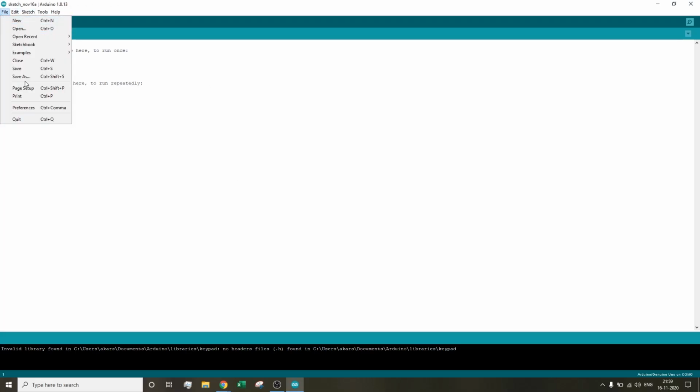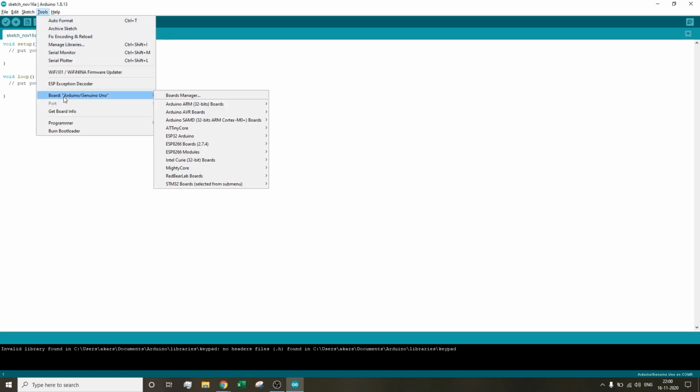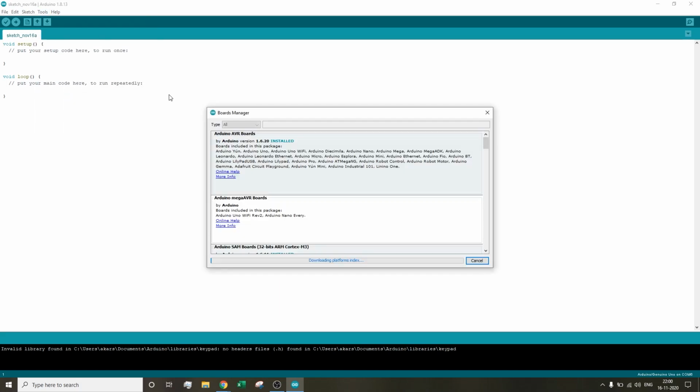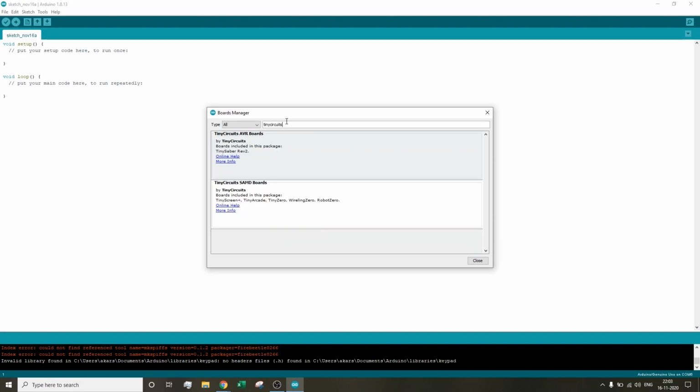In the IDE, we need to head over to Preferences and paste the URL in the additional boards manager URLs separated by a comma. Once that is done, we need to go to Tools, then Boards, and then Boards Manager. In the Boards Manager, we need to install the Arduino SAMD boards. Once that is done, you need to install the Tiny Circuits SAMD boards as well.